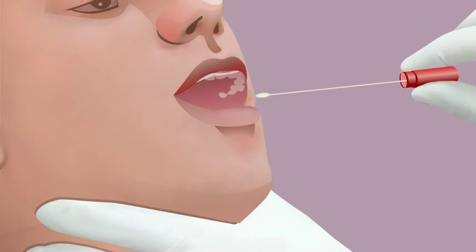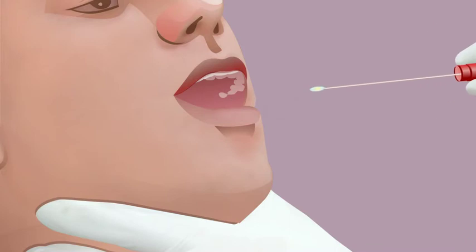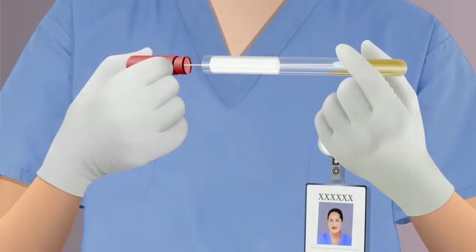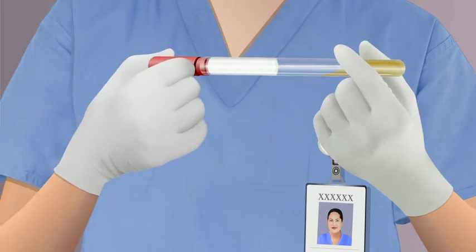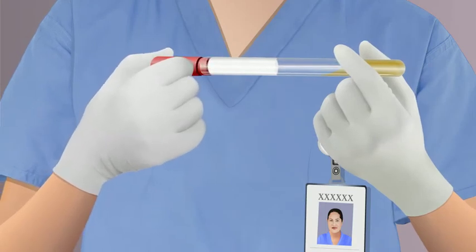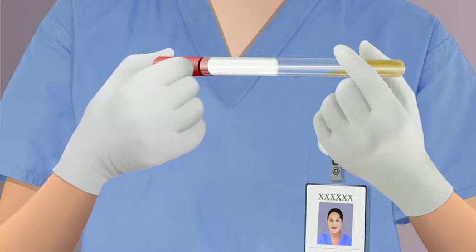Carefully withdraw the swab without touching the oral structures. Insert the swab into the culture tube and push the tip into the liquid medium at the bottom of the tube. Secure the top of the culture tube.